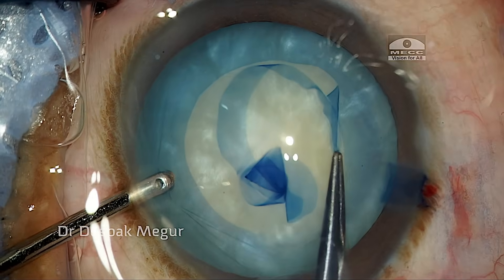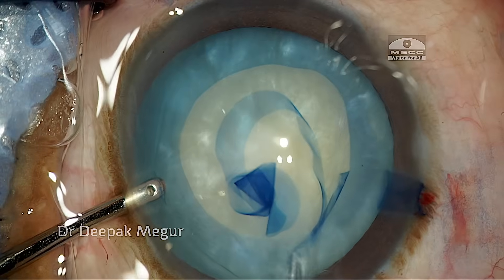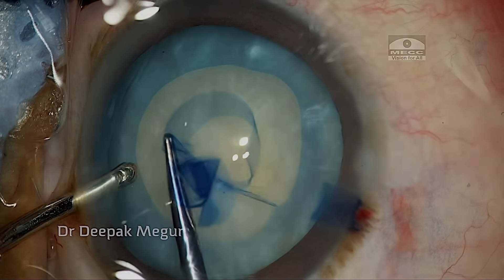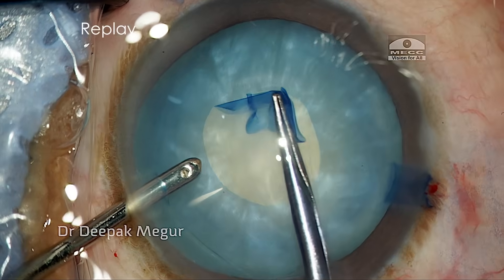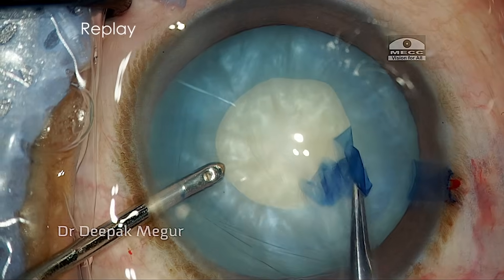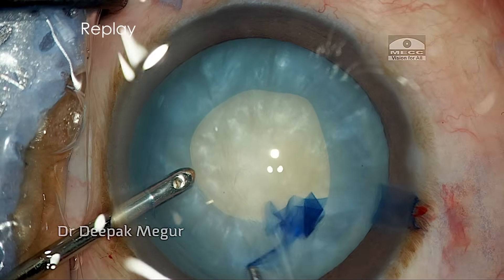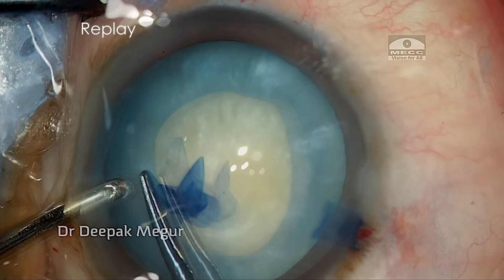The trick here is to hold the capsule, tear it a little bit, then leave it and re-grasp it. These multiple episodes of folding and re-grasping ensure better control over the way we tear the anterior capsule. It is definitely much more controlled and we can enlarge it to the appropriate size as we wish.